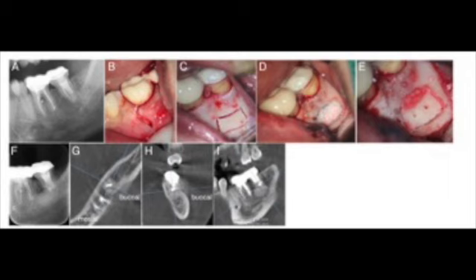Also, I think this procedure will take longer than normal apical surgeries because of its nature of trying to remove that bony lid in one piece and trying to fix it in its place in one piece also.